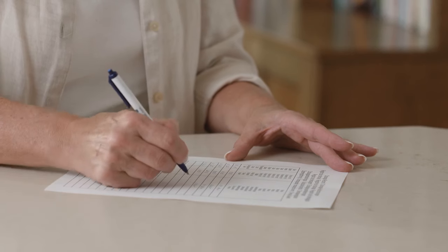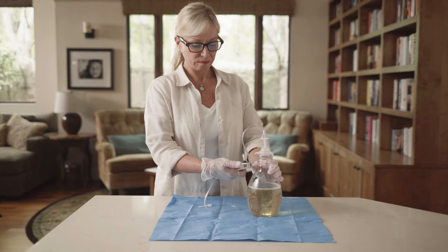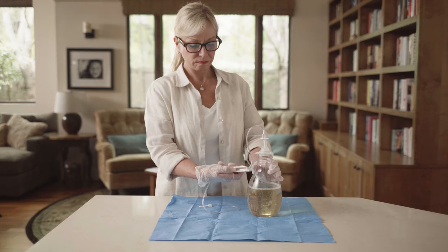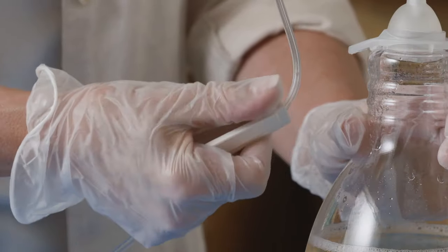Record the volume of fluid drained on the drainage chart or in the Plurex app. Open the roller clamp on the drainage line by rolling the wheel away from the bottle to release any vacuum left in the bottle, then close the clamp on the drainage line completely by moving the wheel toward the bottle.